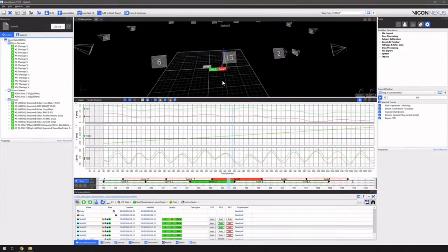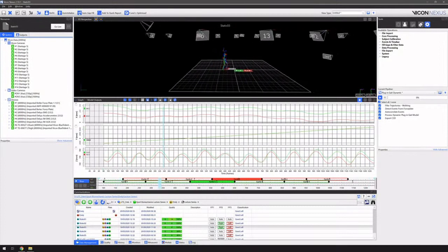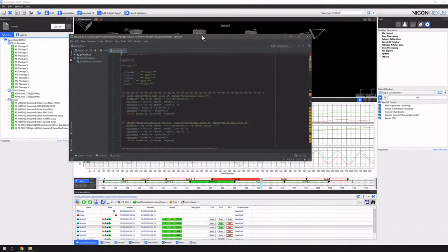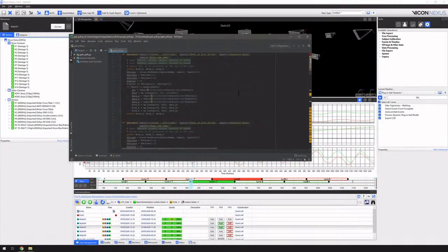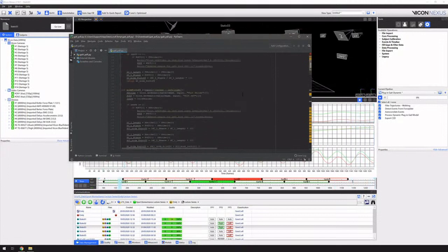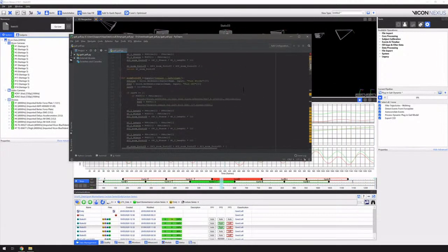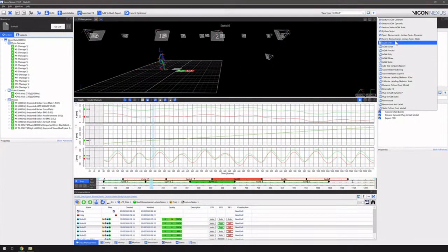In the previous session, Jacques also talked about the modeling options available to us. Here I have a Python script which takes the kinematics, normalizes the data for each gait cycle, and displays them in a PDF. I can run this script through a Nexus pipeline like so.